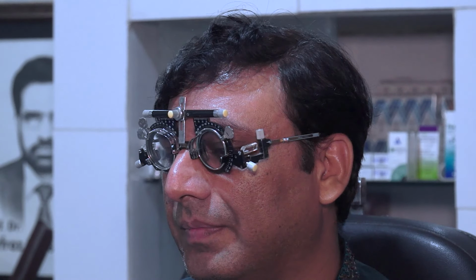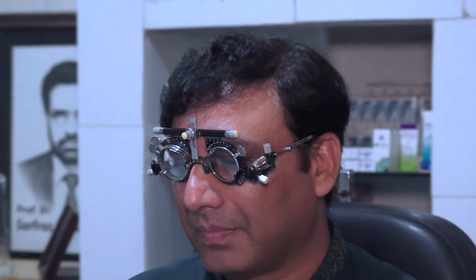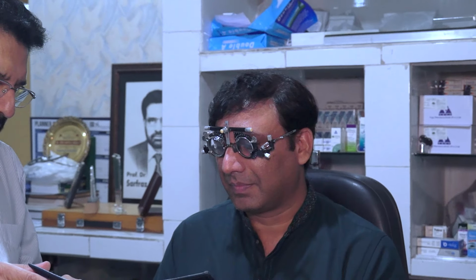Now this is it. Now we are going to check the reading, the near vision of the patient. So can you read this line easily? Yeah, I can read. Can you read this one as well? Yeah, I can read. Can you read this one? This one also. And this one? This one also. How old are you?